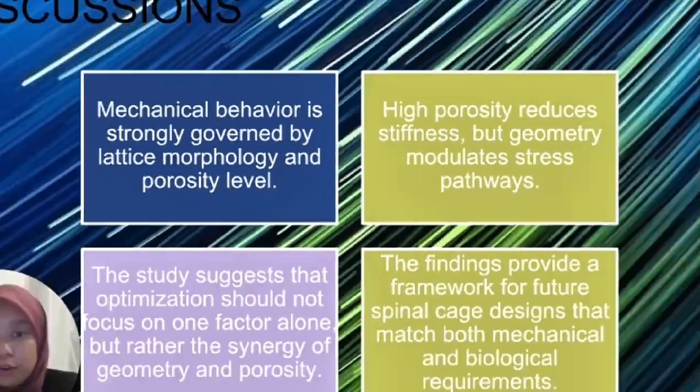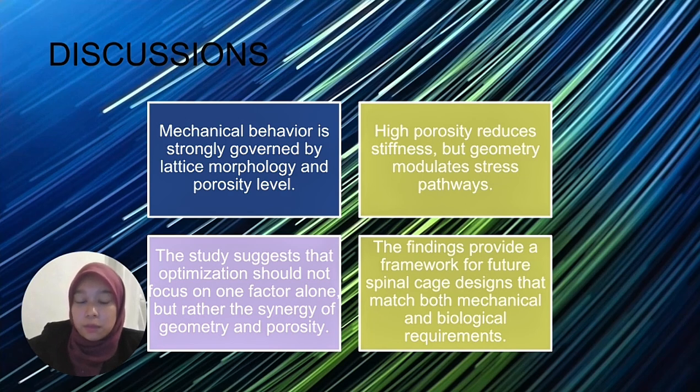We have four points to discuss. First, the mechanical behavior is strongly governed by the lattice morphology and the porosity level. Second, high porosity reduces stiffness but geometry modulates the stress pathway. This study suggests that optimization should not focus on the porosity factor alone, but rather the synergy of the geometry and porosity. Lastly, the findings provide a framework for future spinal cage design that meets both mechanical and biological requirements.